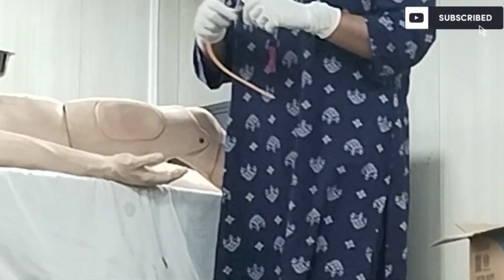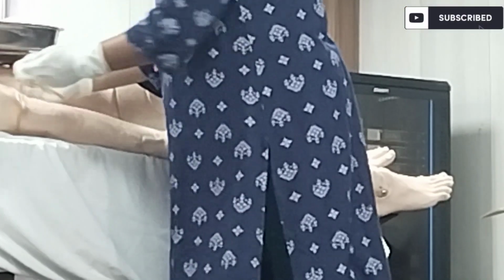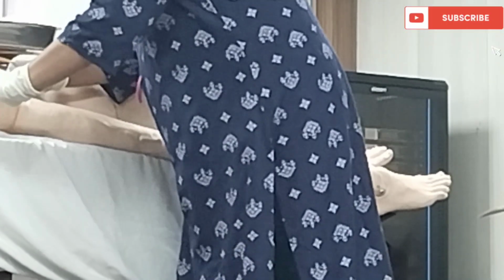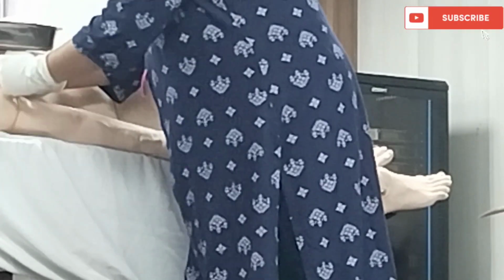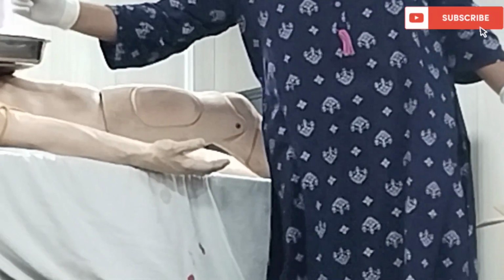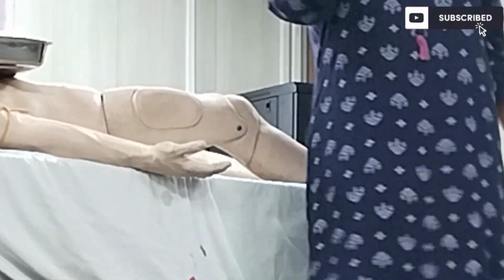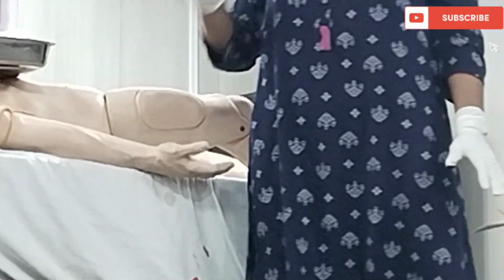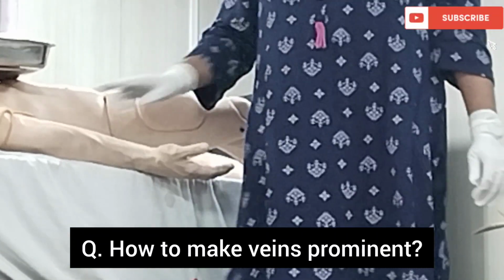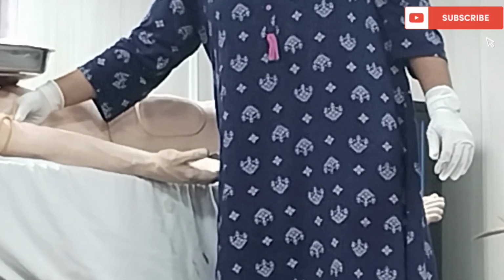After that, you will have the tourniquet with you. You will bind the tourniquet just 1 inch above the antecubital fossa and bind it in such a way that with one draw of the hand you can take it out. It is not that difficult. After that, you ask the patient to clench the fist. These are the maneuvers to make the veins prominent. Clench the fist, tap the area. Then you can palpate the vein becoming prominent.